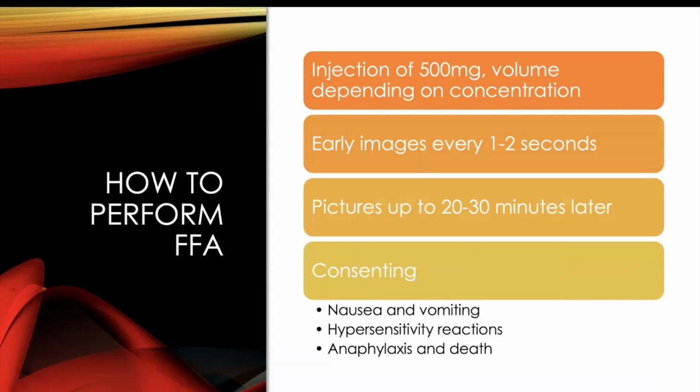Some of you may be involved with actually consenting your patients for an FFA in your medical retina exams. So the most common side effect of an FFA is actually just some nausea, some vomiting, generally feeling a bit unwell, maybe some fainting. Hypersensitivity reactions are quite rare, but they may actually develop a rash, in which case you might find that whenever somebody does have some FFA, they do have some oral antihistamines to hand.